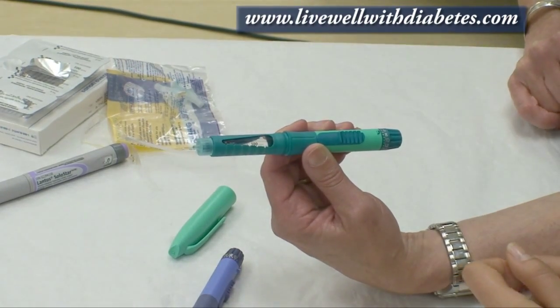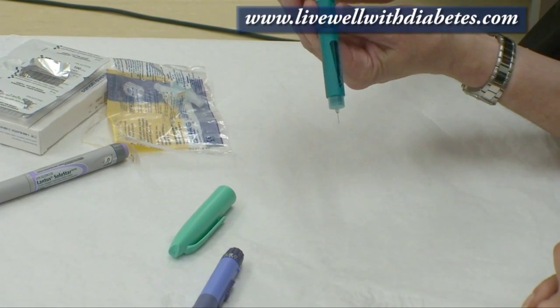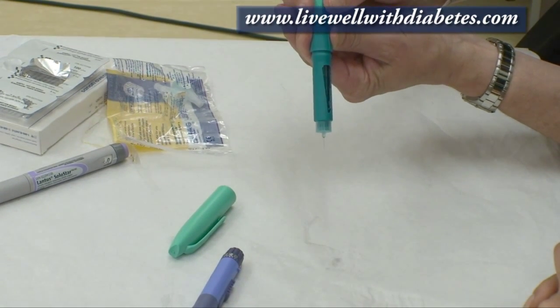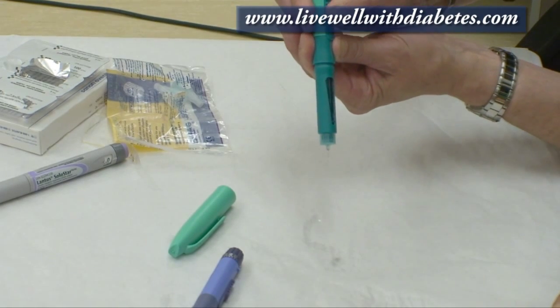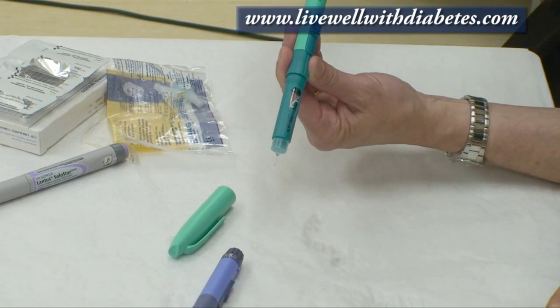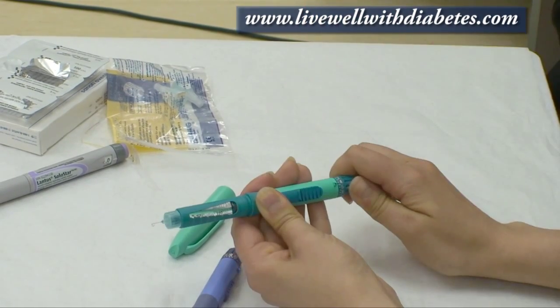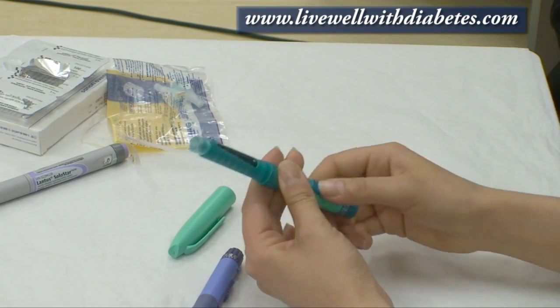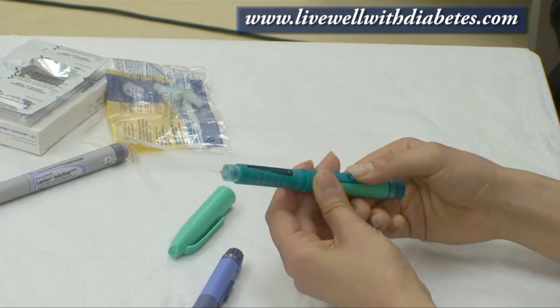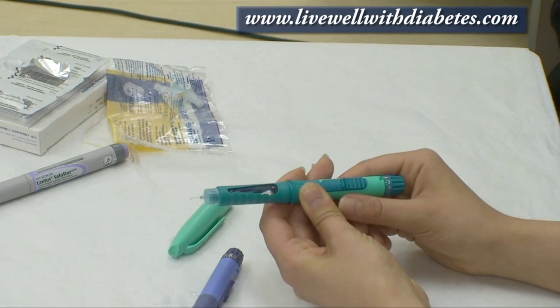Do you want to try that? Sure. I'll just waste this insulin by sliding the button down. So if I'd given that injection I'd hold that in my tummy for about six seconds and then the dial will come back to the solid line. So that's seven — then just slide it down.